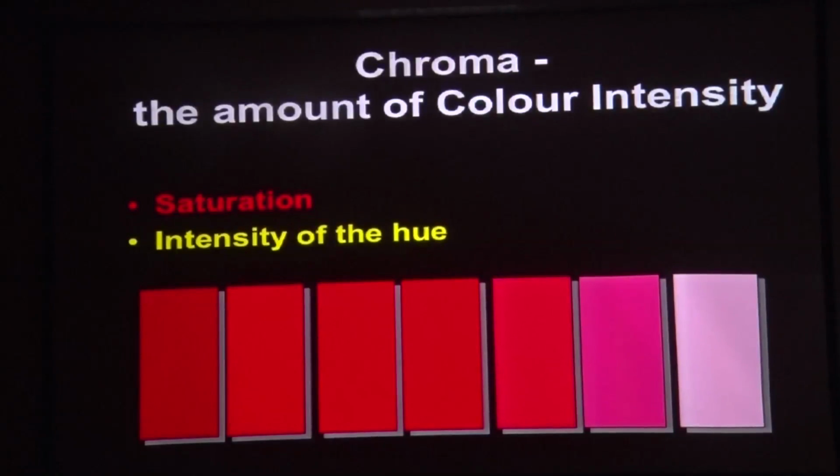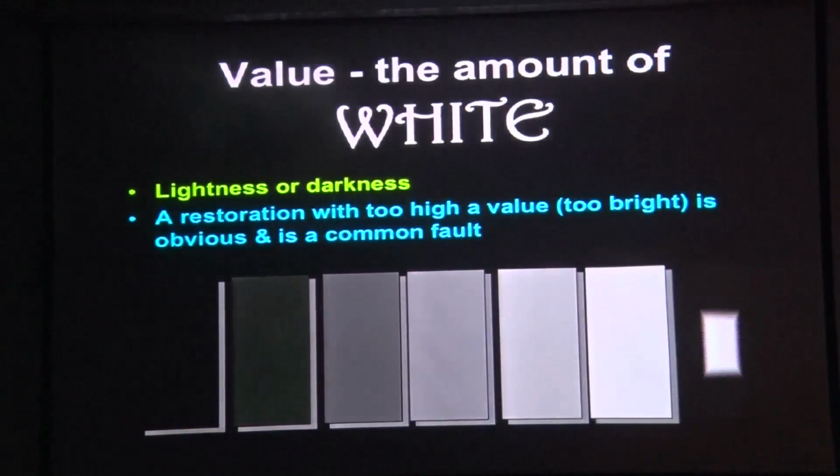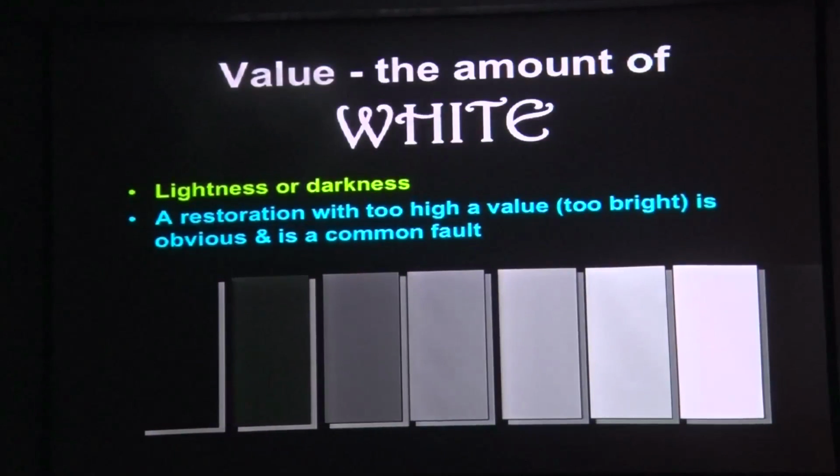So now I make my tooth look polychromatic. So you really cannot communicate just A to your technician. It's very important that you give three different chromas. That's the second step. And the third step is value. This will make or break your restoration. Now you have to accurately assess the brightness or darkness of the color of the tooth.